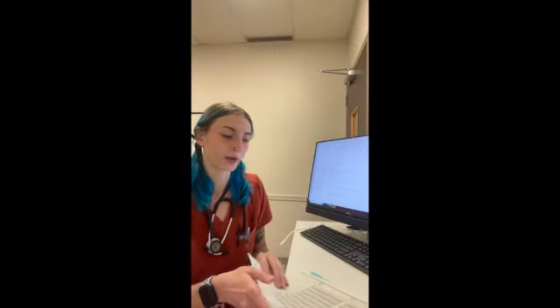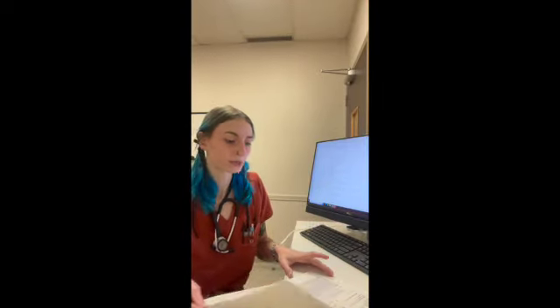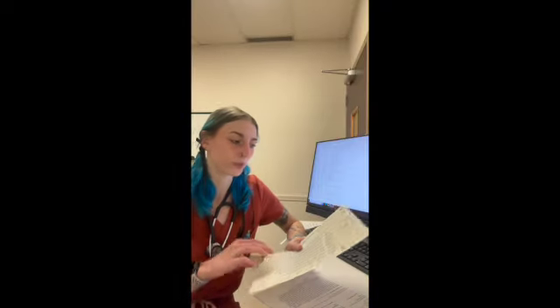And so once we have our anesthetic protocol developed, we will now obtain the patient and begin our anesthesia protocol. And once the patient has been brought into anesthesia, we will then begin our anesthetic record. So this is what our anesthetic record looks like here at our hospital. It's pretty intimidating, I'm not gonna lie. It can be a lot, but we'll go over it.